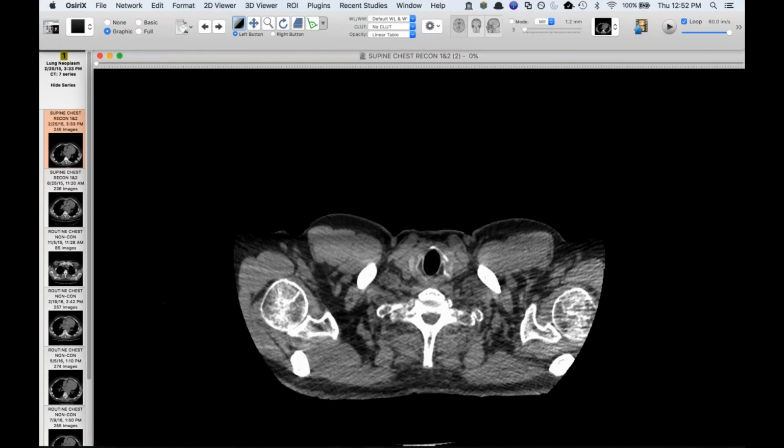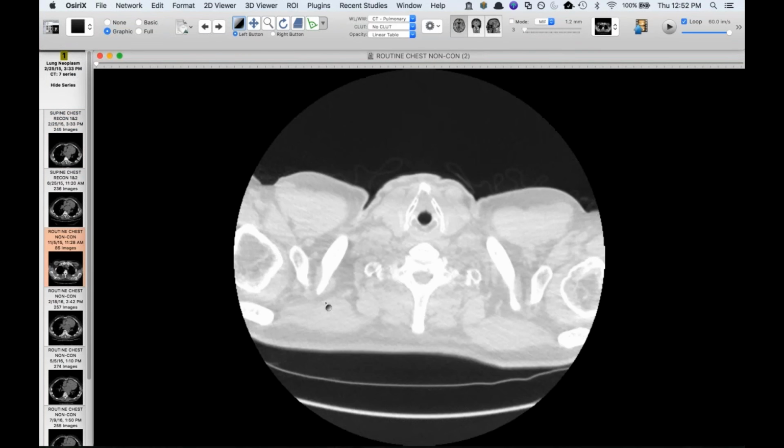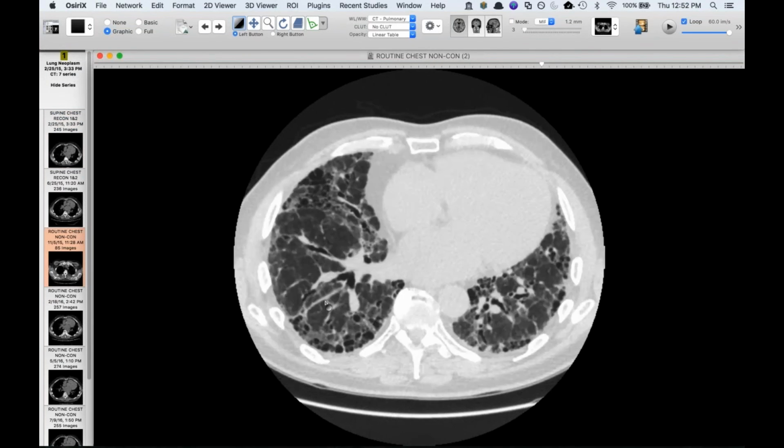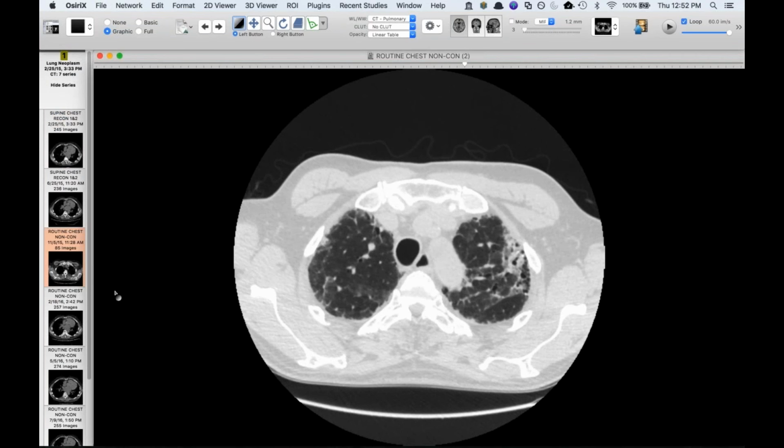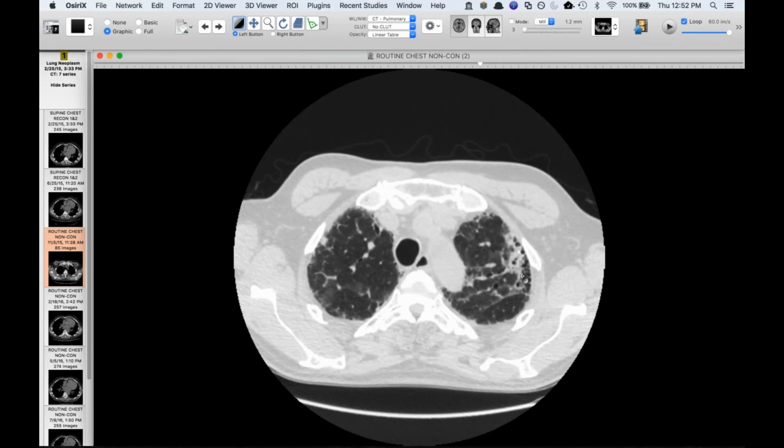This is one of those cases that is confusing to some degree. So this patient has UIP. Oh no, I don't think I have the complete series here. But anyway, actually I have the important part. So this is one I read back in November of last year, you'll see. And this guy, he has UIP, IPF, he's in his 60s, and he has this, what was new at the time, band of consolidation here in the left upper lobe.